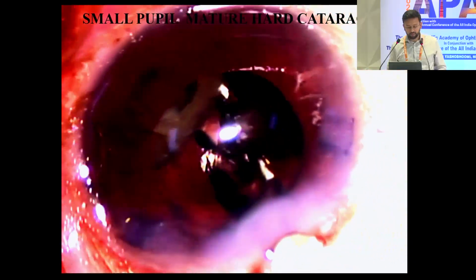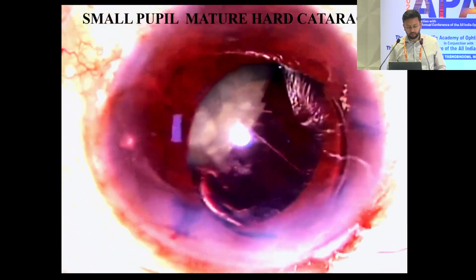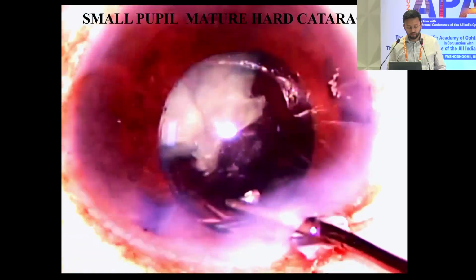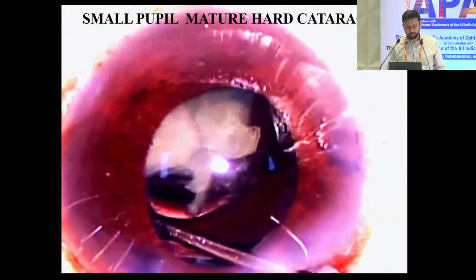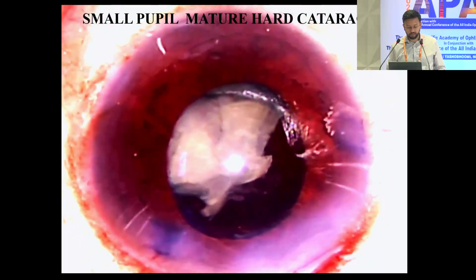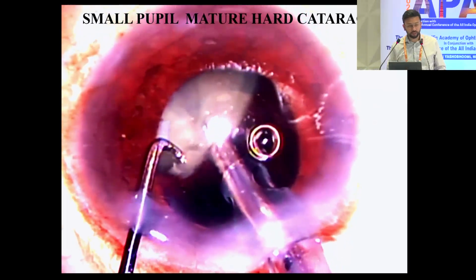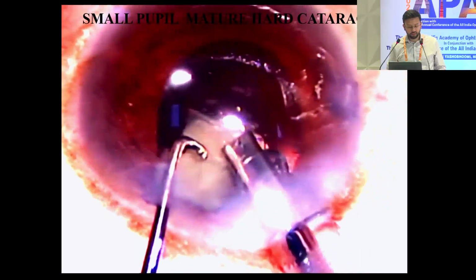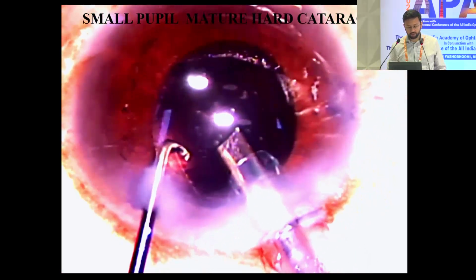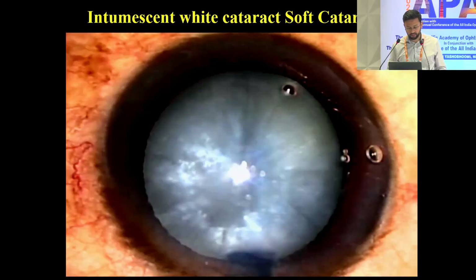So here again we are attempting to scaffold the tear with the IOL. We are placing the IOL here in the sulcus, under the fragment. We carefully place the leading haptic in the sulcus first. Now we can easily emulsify the remaining nuclear fragments without chances of loss in the vitreous. These steps can be performed only when you're sure that there is no vitreous prolapse already happening, because if there is vitreous in the AC, then we cannot attempt these steps.